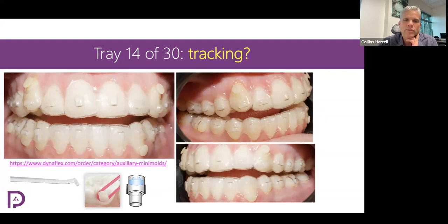I've also seen people prepare the tooth and use a rubber orthodontic separator, placing it right on the tooth and pouring flowable composite in there so that it spills over the top of the little rubber donut, then curing it and pulling the donut off, and it leaves a button. Anything that you can create that will hold an elastic is acceptable. You can put a clear bracket on the tooth that's got a hook on it. Whatever is comfortable for the patient and can hold an elastic is acceptable.